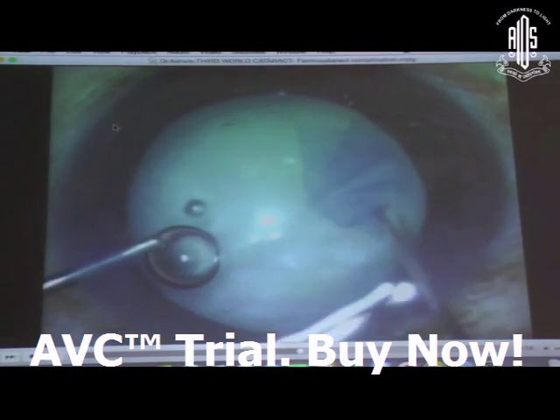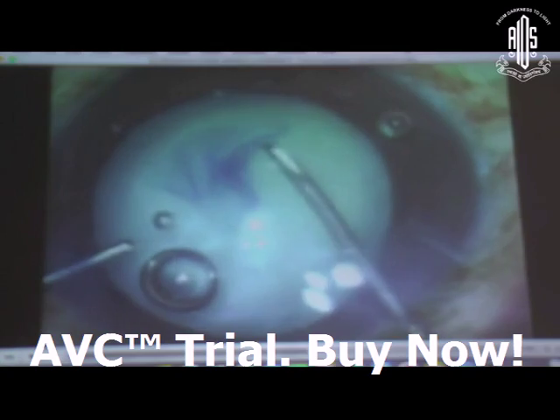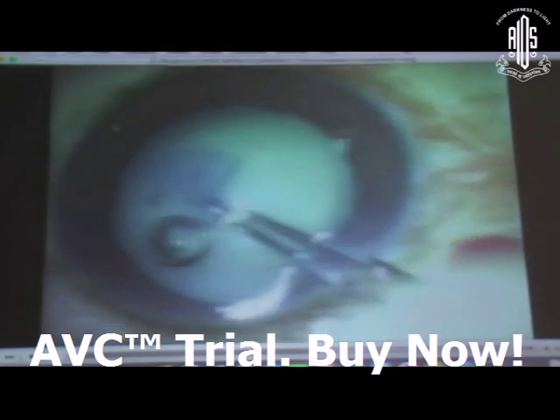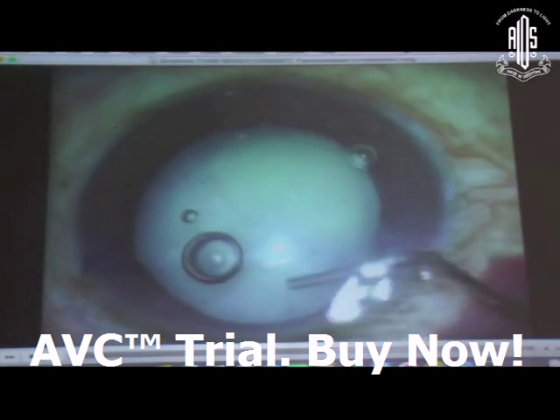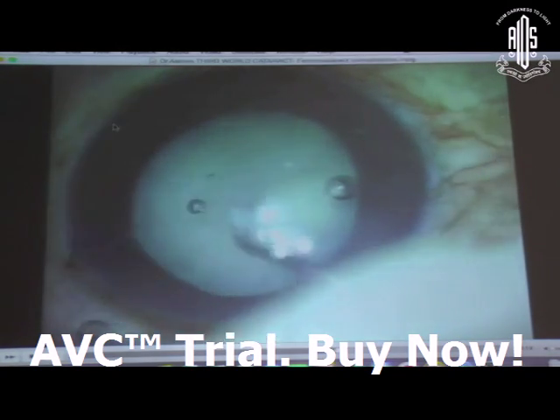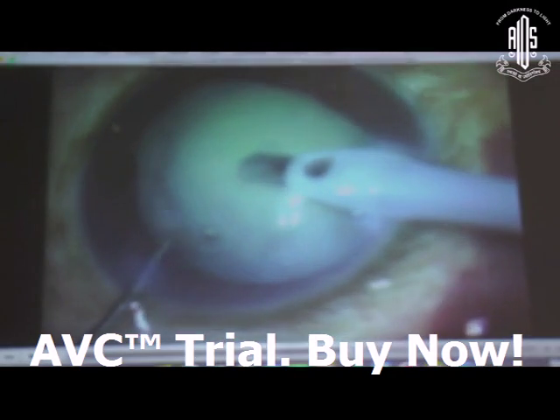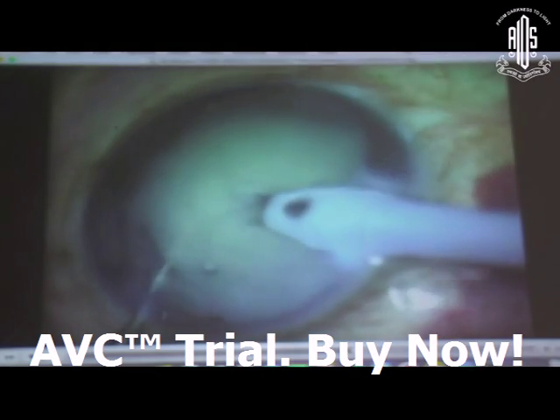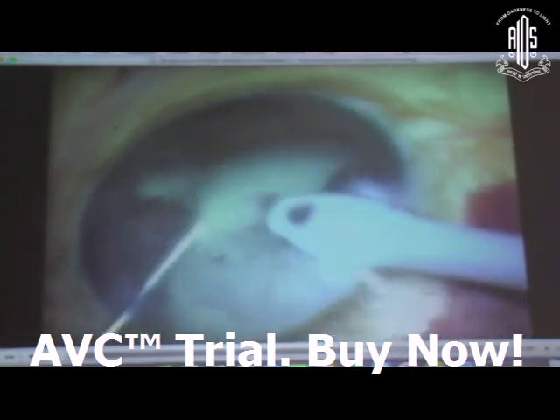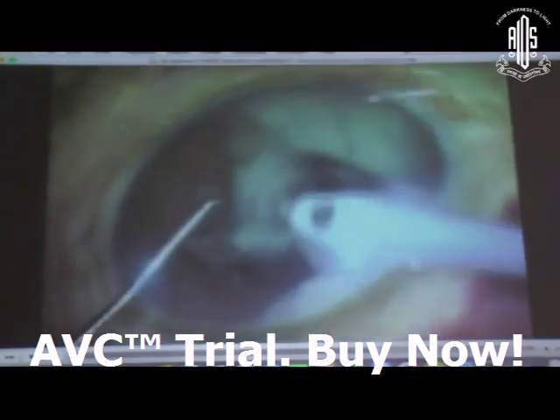So you can see in the femto, you have certain issues which can happen like this. Rhexis has been completed. Once the rhexis is completed, the rest of the procedure becomes easy. But notice in this case, once again, fragmentation has not occurred. If you saw Keki's videos, a nice fragmentation had occurred very nicely in the surgery. In this particular case, it did not happen. So once again, we just go in with phacoemulsification, and since it's a mature cataract, not a hard mature cataract, in these cases we always use our air pump, and once you have that on, we chop it with any method which you want and emulsify it.